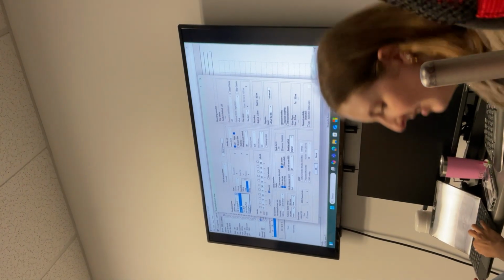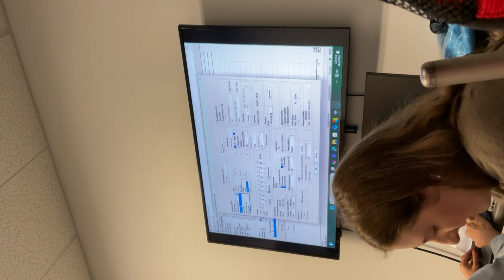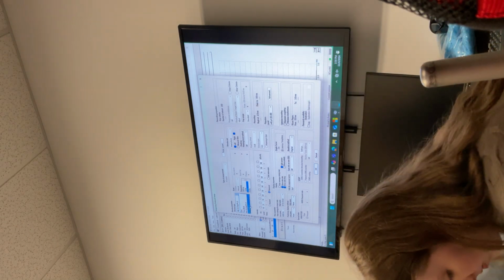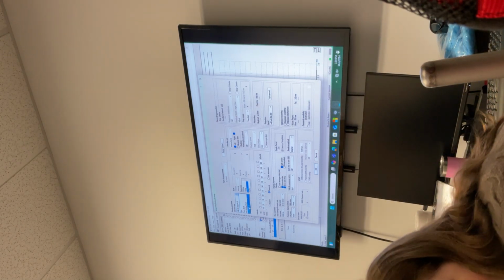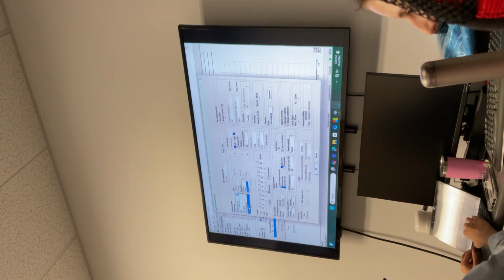There is no frequency-specific click, there is no 500 Hz click, there is no 1000 Hz click, okay? Tone burst is frequency specific. The same thing with broadband chirp, or CE chirp, or just chirp, is a broadband stimulus. It's a counterpart to the click. Then narrowband CE chirp, that's the counterpart to the tone burst.